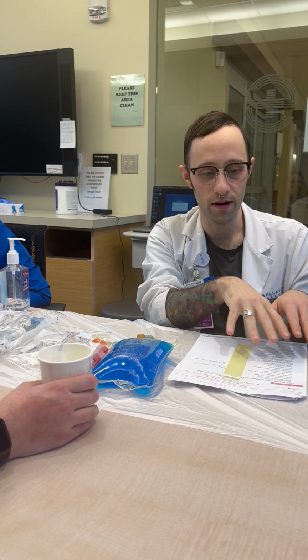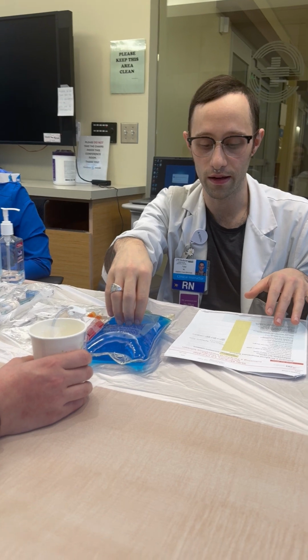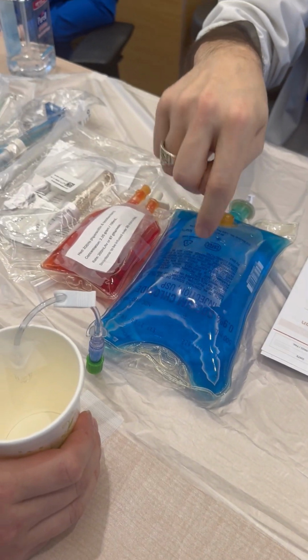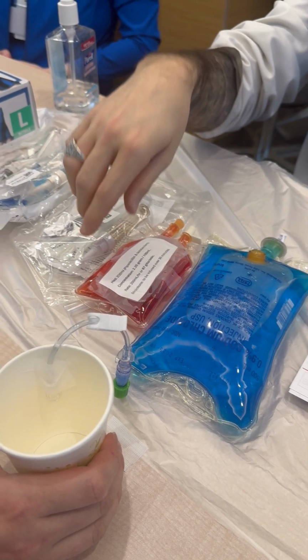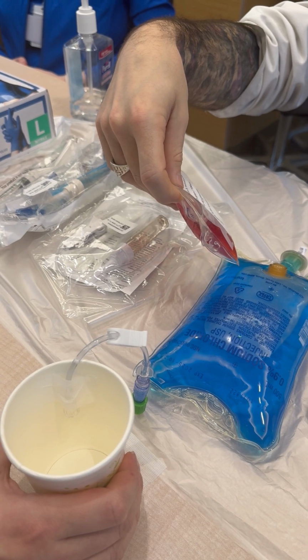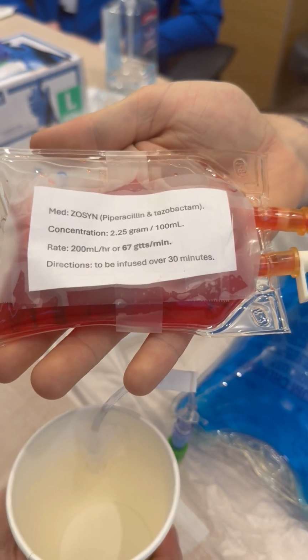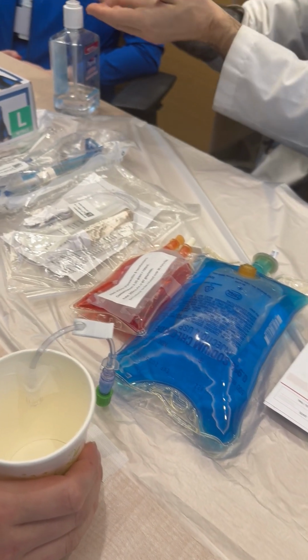So I'm gonna check the MAR, and it looks like we have maintenance fluids, normal saline, 125 milliliters per hour, and then also Zosyn for the infection, and this is to be infused as an IV piggyback over 30 minutes. So we'll go ahead and get those going. I'm going to do some hand hygiene.